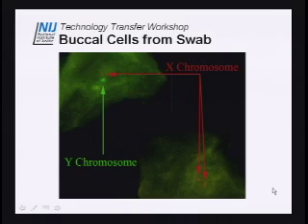We're one of the few people, actually, I think, in the world that have done something like this on forensic type samples. I know other places have done it, and I think Britain has really put a lot of money into it. But this is one of the first slides. This slide is actually about a year and a half old. This was done a long time ago. And it does work. So this is a technology we see. It will work, it can work, and it works on forensic samples.